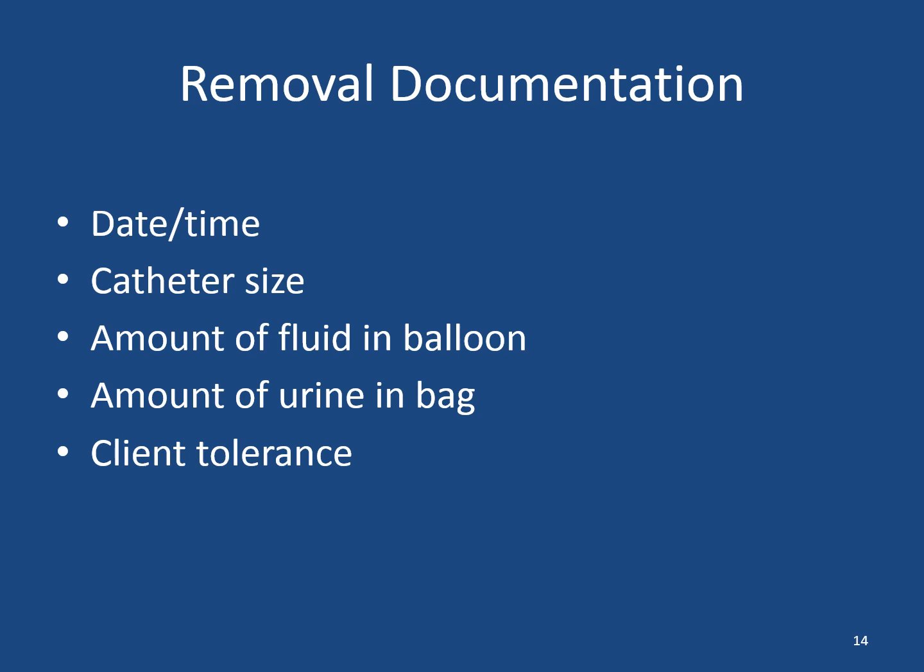Removal documentation. So for this, you would want to make sure that you have the date and time that you're removing it, the catheter size that you removed, the amount of fluid in the balloon, the amount of urine that was in the bag, how much urine you removed from the client, and how the client tolerated it.